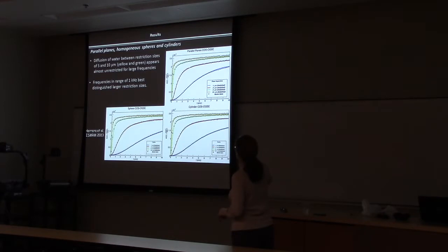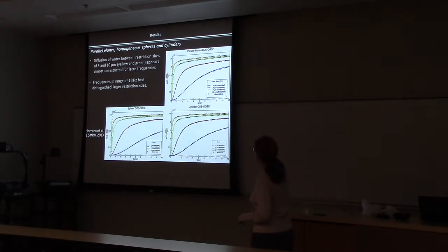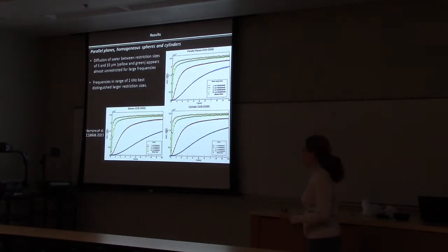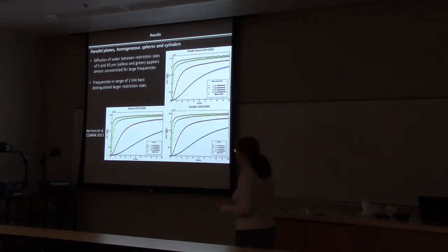This one is 2 microns, and this one is 1 micron. We haven't even hit free diffusion in this 1 micron all the way up to 10 kilohertz. We kind of get the mean, which is what I'm looking for, for the 2 microns at around 2.5, 3 kilohertz. So we're aiming with that. Trevor's analytical models are shown with the lines, and from that you can tell how big these are.